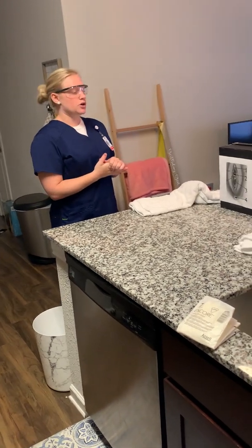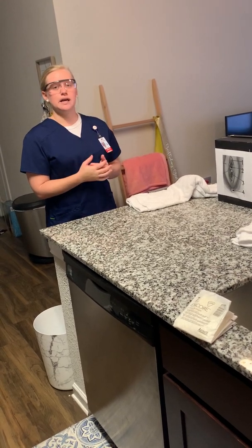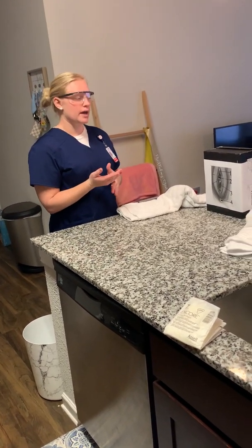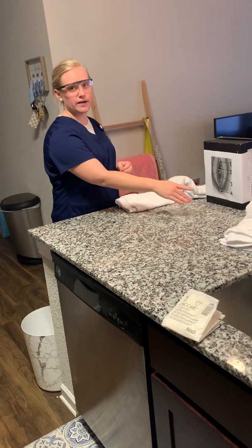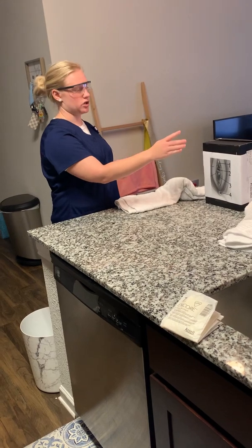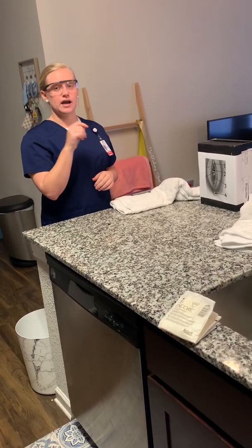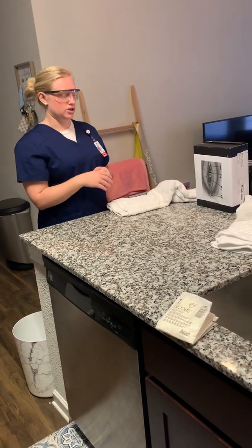perineal care. So with perineal care, I want to do this with soap and water, and this will ensure that there's no contamination when inserting the catheter. So for a female, I would use a washcloth and start on the left labia and clean front to back, and then I get a new washcloth and do the right labia front to back, and then go down the middle with another washcloth to go front to back. So for a male, I would hold the shaft of the penis, and starting at the tip with inner to outer, I go in circular motions and using a different washcloth with each thing.